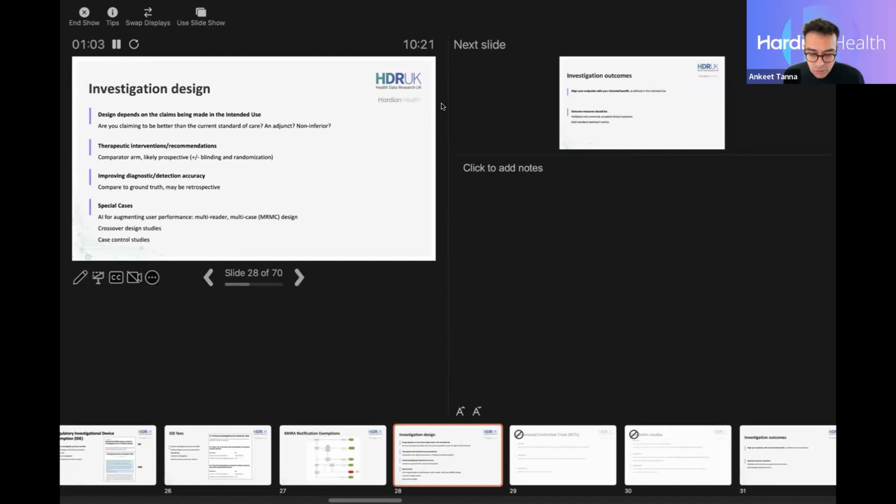Hi, everyone. Hope you had a good break. So for the next part, we'll talk about the details about investigation design. Obviously, the limits are, we can't go into too much detail because, as the first point says, it highly depends on the claims being made in the intended use.